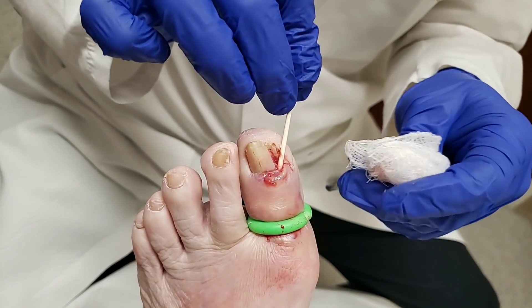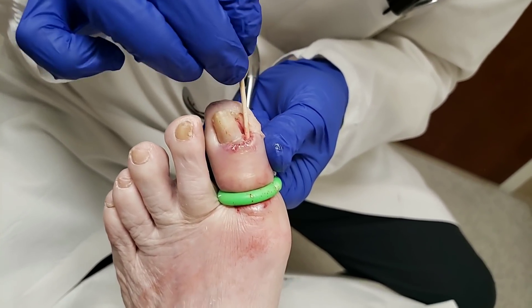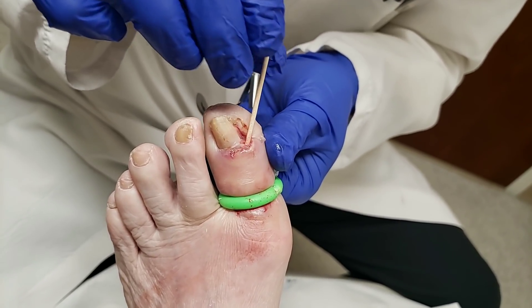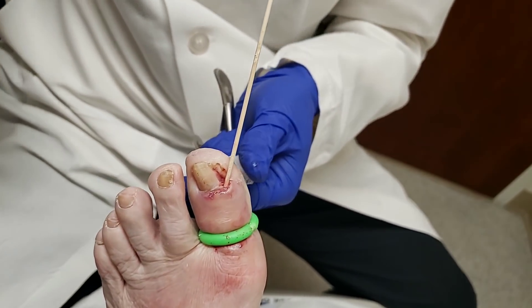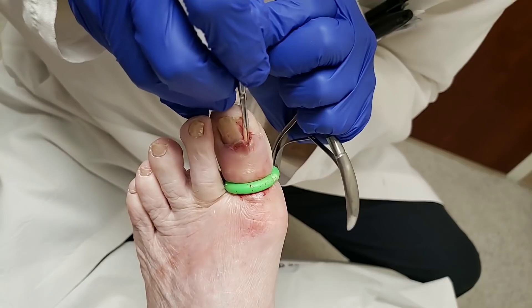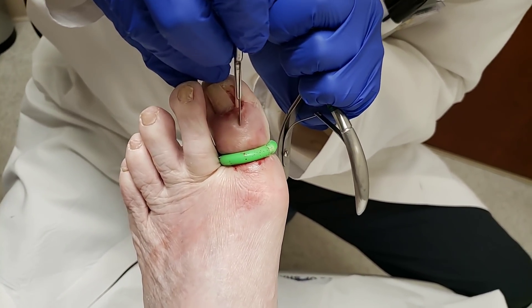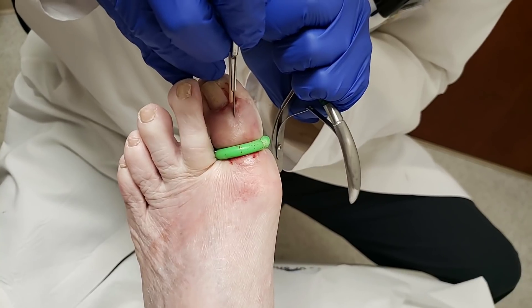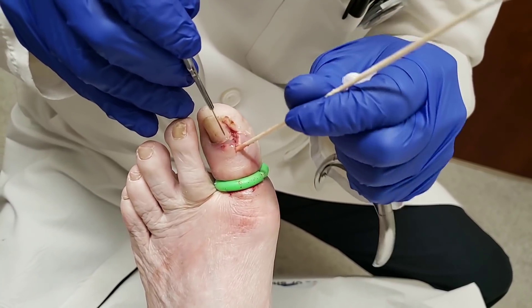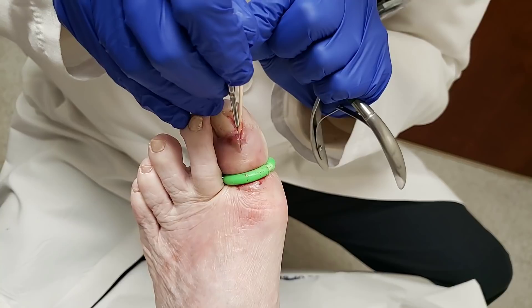We want to keep this kind of open for this patient. Since it's probing here and over there, I try to pick the midway point and open up the skin here. You can see we just open it up wherever it goes, and that's going to help it to drain.